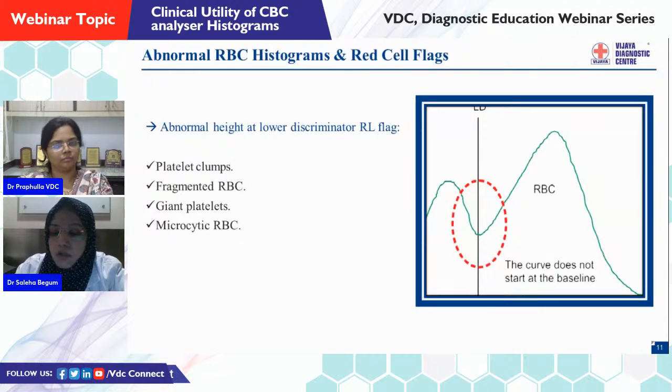Okay, having seen the normal RBC graph, let us see what could be the abnormalities in the graph. Here you can see the RBC graph. The curve is not starting at the baseline. Instead, it is somewhere in the middle of the lower discriminator.